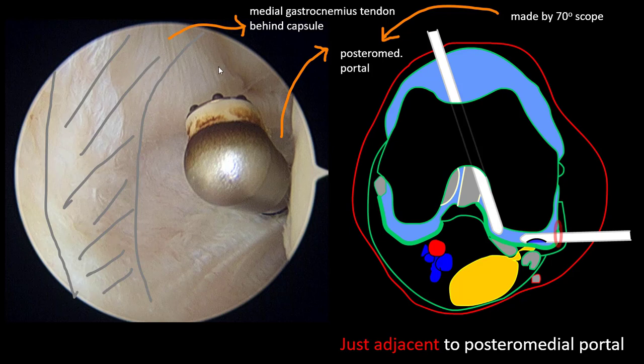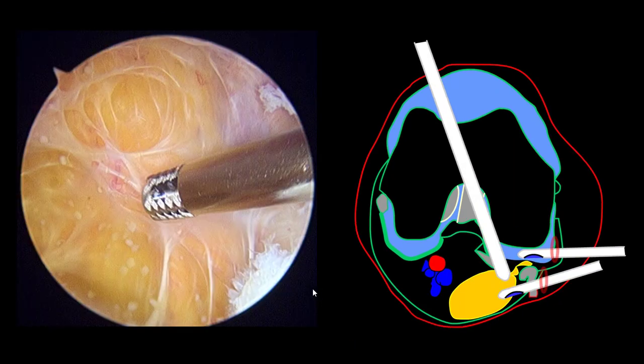Over there — I think this is the check valve, but I'm not sure because I cannot clearly delineate it. This is the medial head of the gastrocnemius. Through the posterior medial or direct cystic portal, you can remove the cyst.